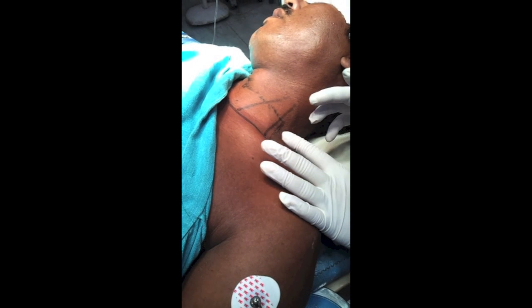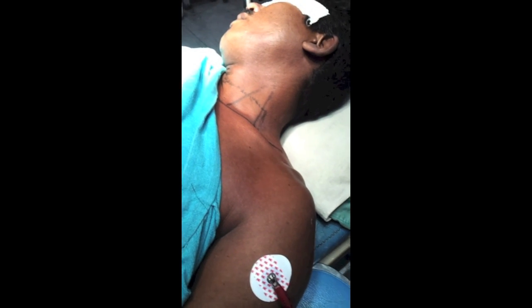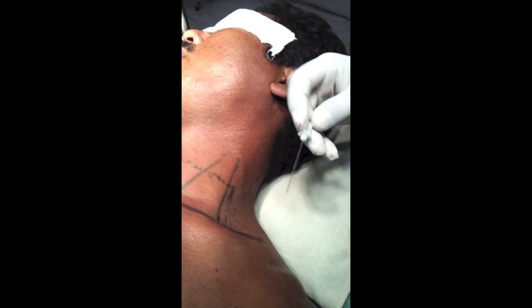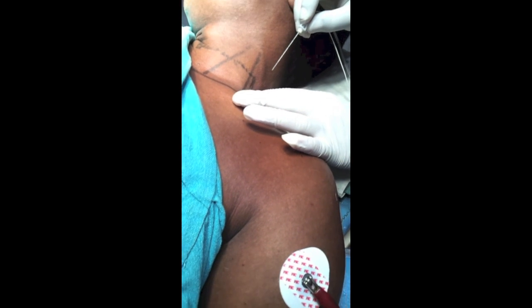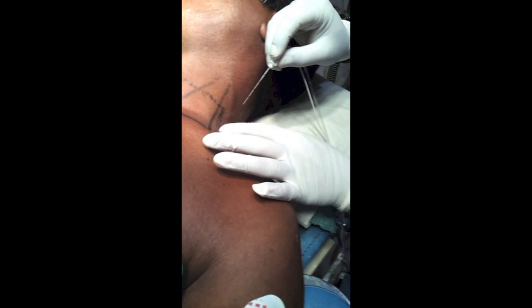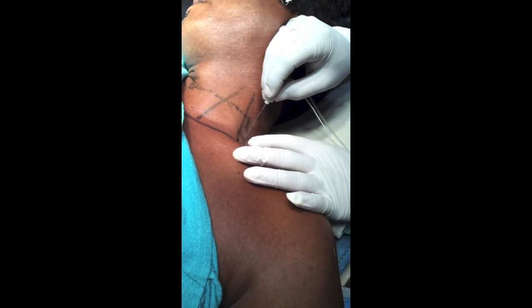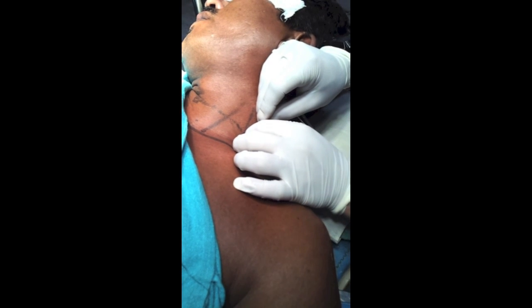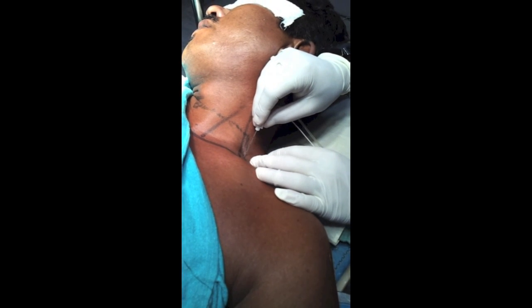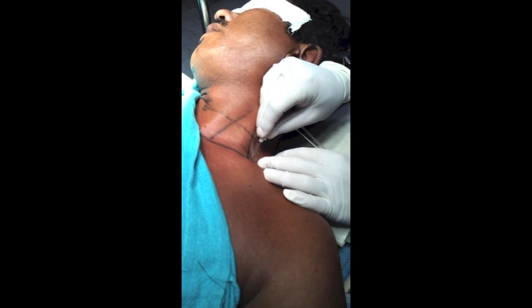Now we will go for the injection technique. A 50 mm Stimuplex needle is used, primed with local anesthetic. As the surgery is at the mid-arm level, the injection point will be at least two centimeters above the clavicle.